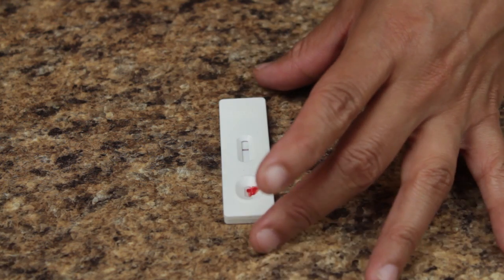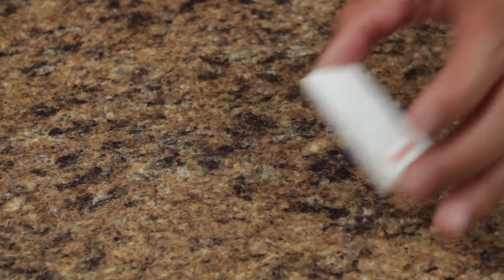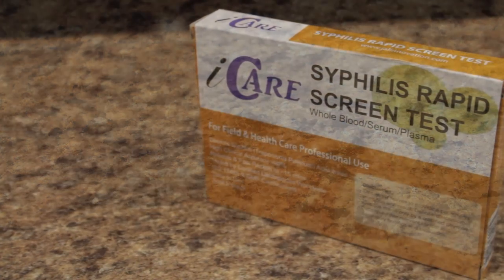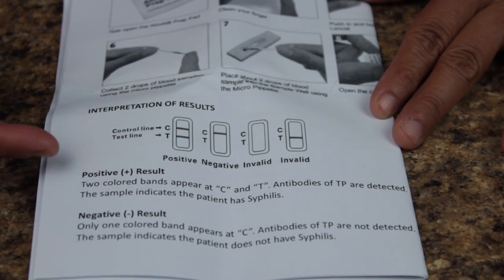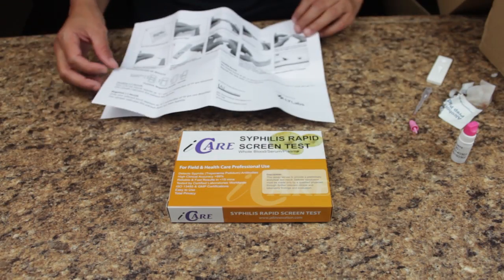Please dispose of all test components safely after reading your result. The test package includes a guide for interpreting the results. Thank you for choosing iCare.